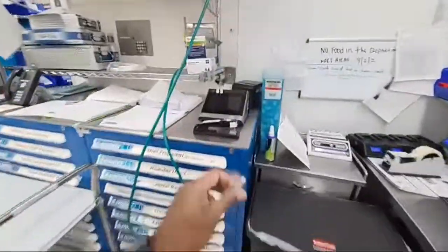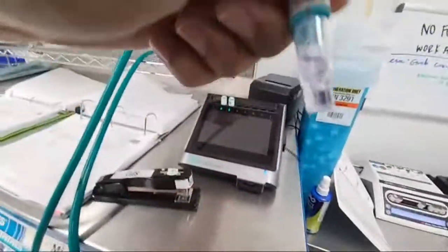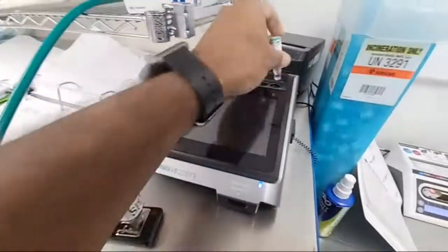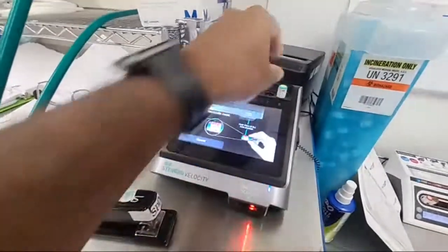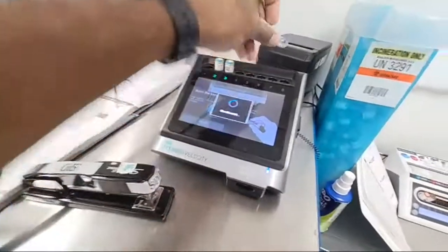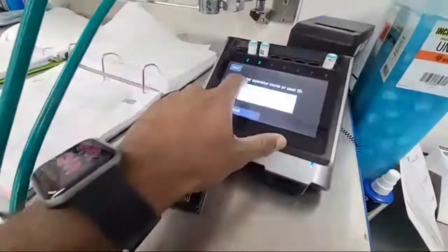So we will take the BI. We will crack the BI. So what I did was I combined the spores with the food, and I like to do it this way. I just pop it in there and it says, oh, you want to do a test? Yes. Then it wants to scan it. It says, okay, that's great. And now I put that back in. It's going to want the information a second.